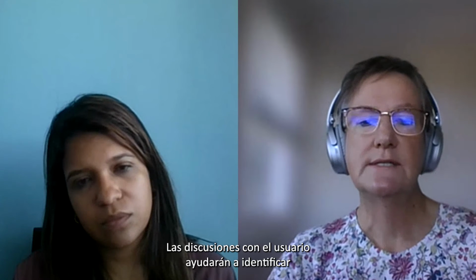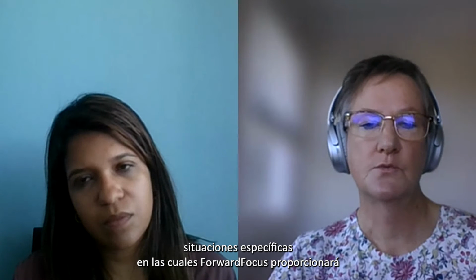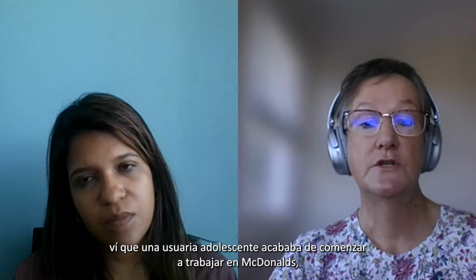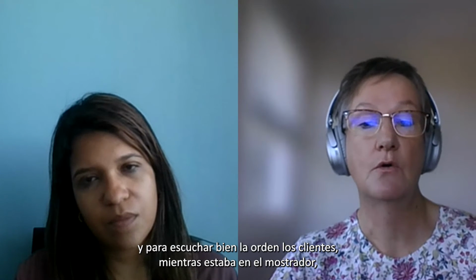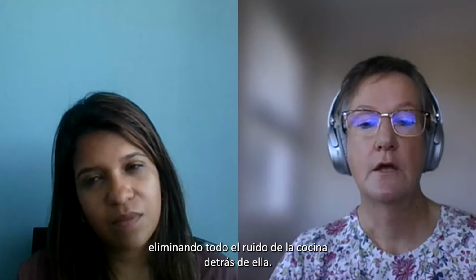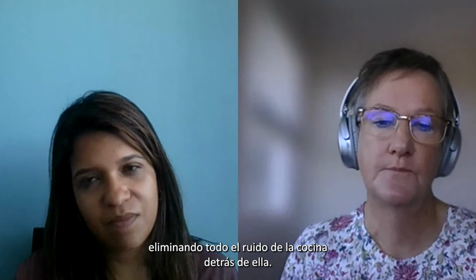Discussions with the recipient will assist in identifying the specific situation in which forward focus will provide significant benefit. When I was in a clinic recently, I saw a teenage recipient who had just started working at McDonald's, and in order to hear customers well while stationed at the counter, she activates forward focus, which makes a huge difference for her, cutting out all the kitchen noise and cooking noise behind her.